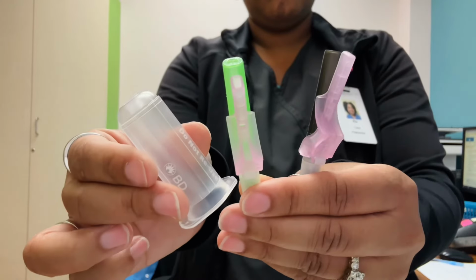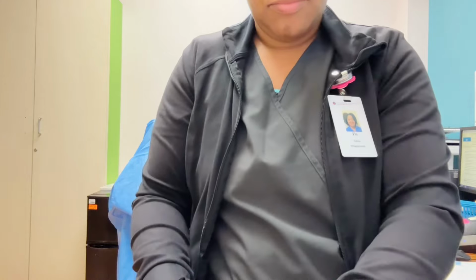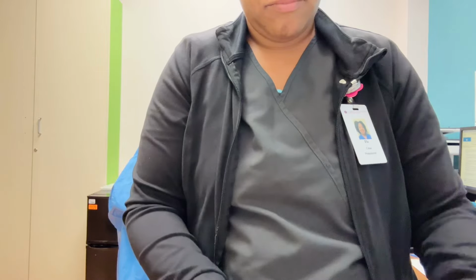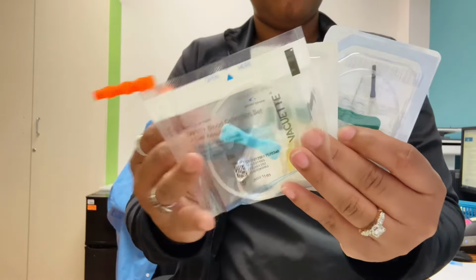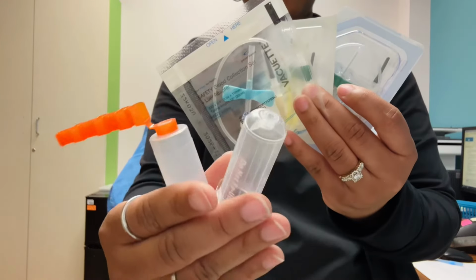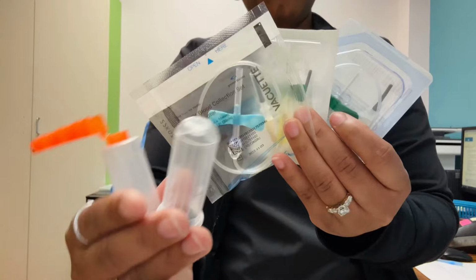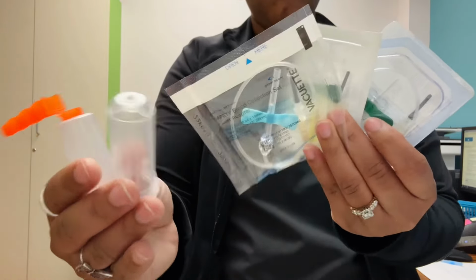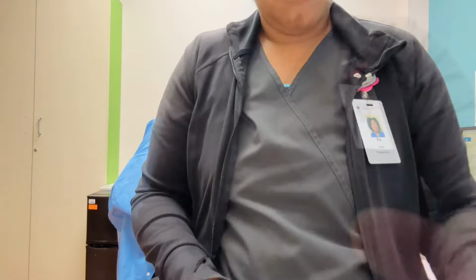Most of the time, your laboratory supply or your managers will supply the right needles with the right hubs. So most of the time, it just depends on where you work. You can mix and match if that's all you have. There's no big problem. Needles and hubs just need to have one another, and at least one of them needs to have some type of safety. Now, for your butterflies, you can use either of the hubcaps. I prefer to use the one without the safety so I can hold on to the one with the safety for my needles that need the safety.